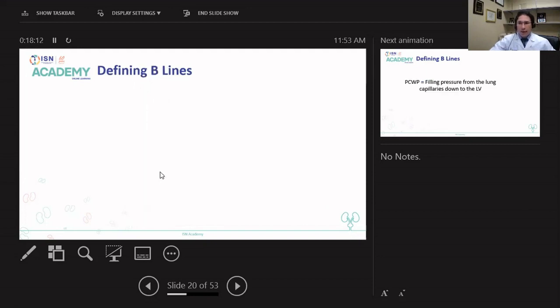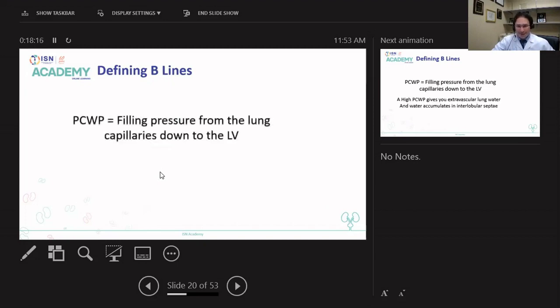So if there are A lines, there have to be B lines. So I want to reset for a minute before we go on to talk about B lines. We'll go into a little bit of cardiovascular hemodynamics.